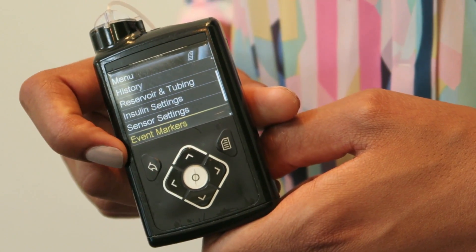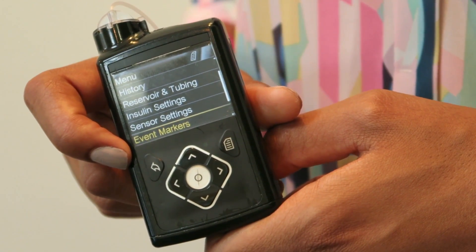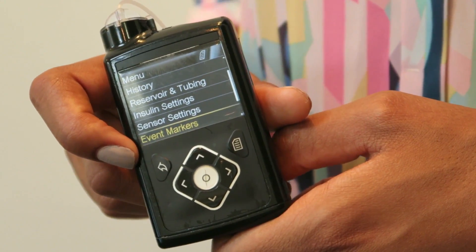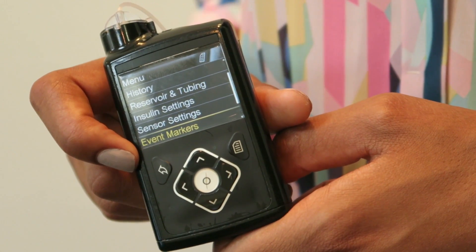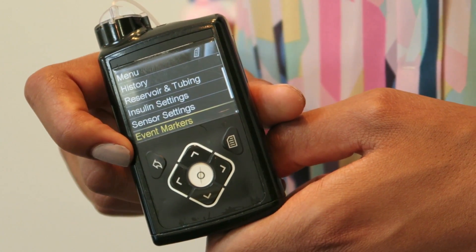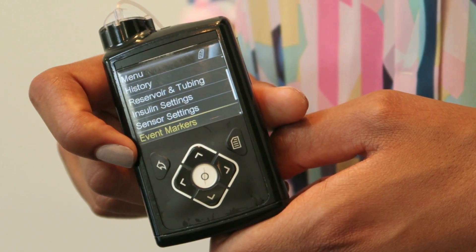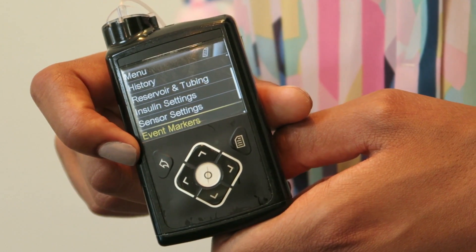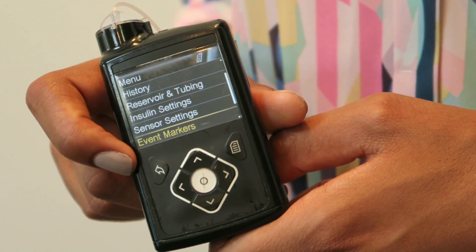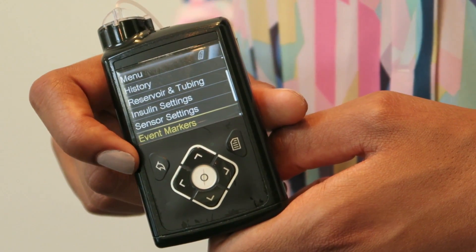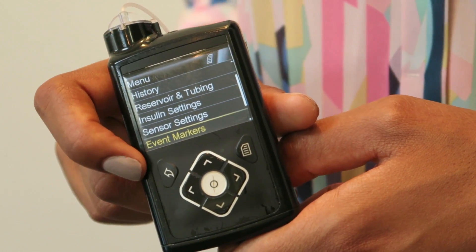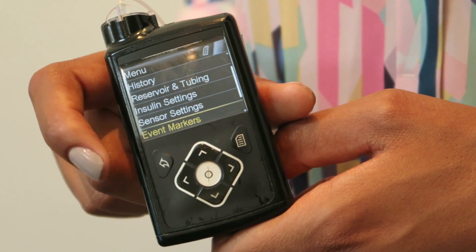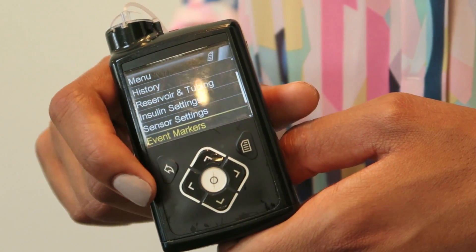the event markers option allows me to write that down and note it, so that when I upload the data later I'm able to see what's been going on. You can also put things like exercise or blood glucose levels in as well.